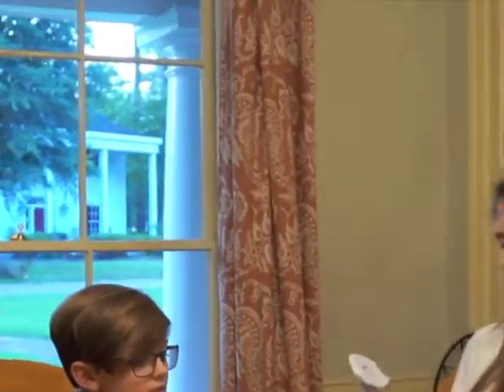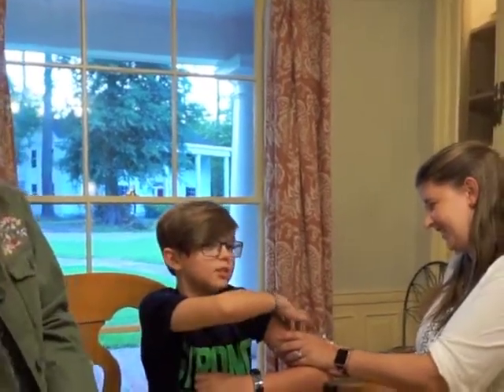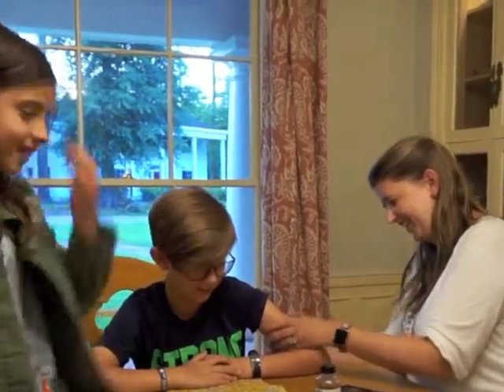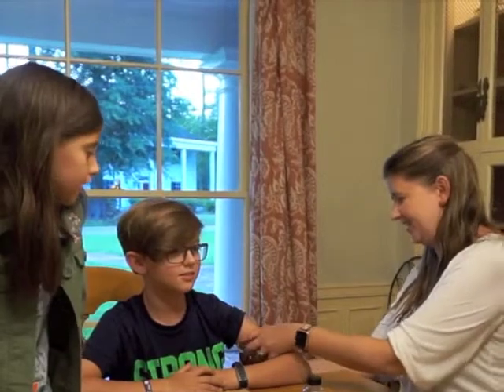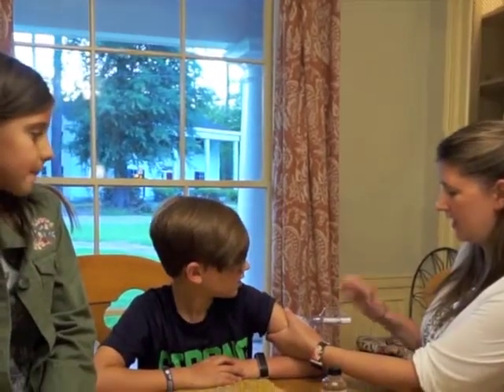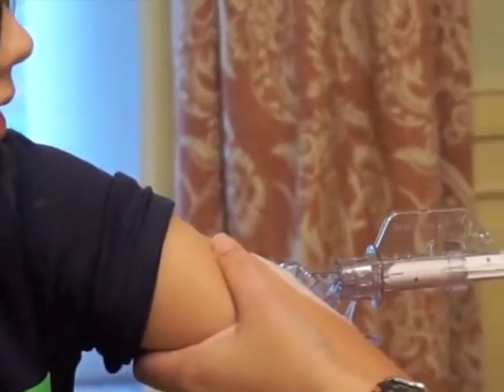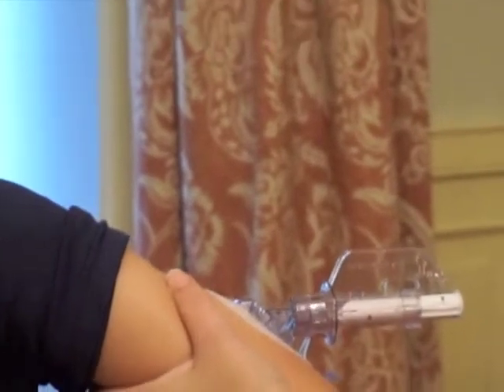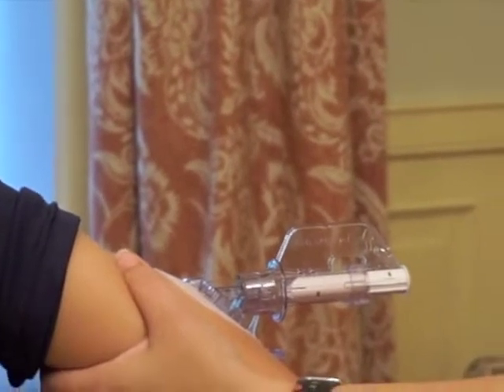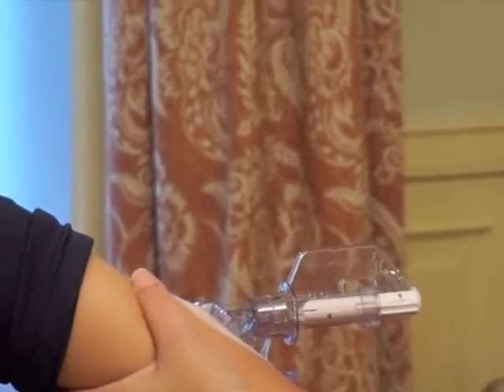At this point you're going to go through a lot of processes. This is the important part — this is what they call the key. As soon as you take the key out, this becomes very sensitive. I learned that the hard way because I accidentally touched it and it stuck him. So as soon as we take the key out, we try to just go ahead and insert it. Always save the key because we'll show you something with it later.